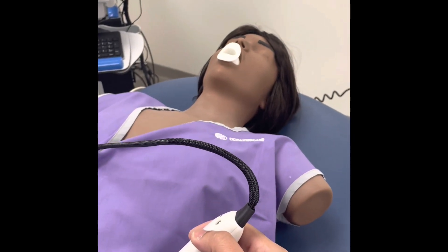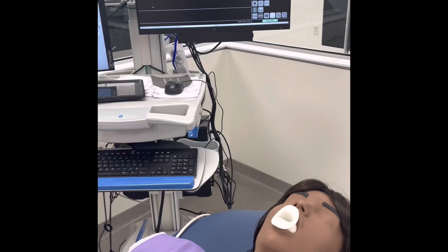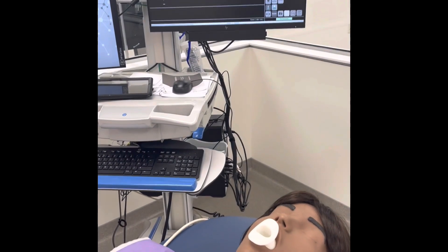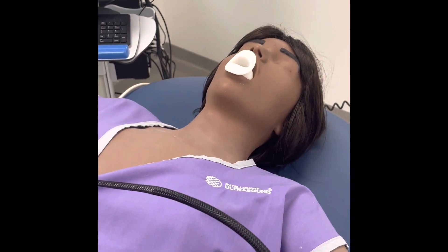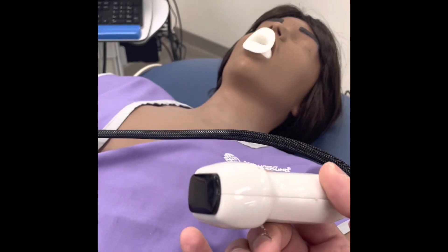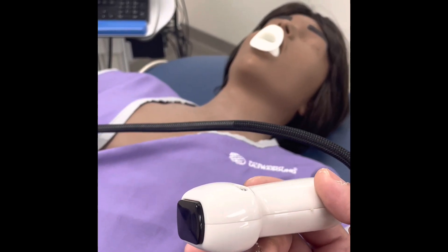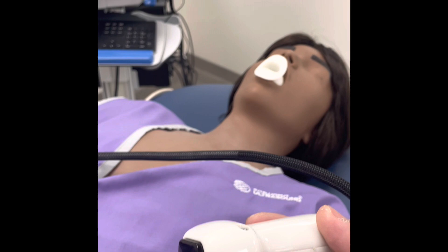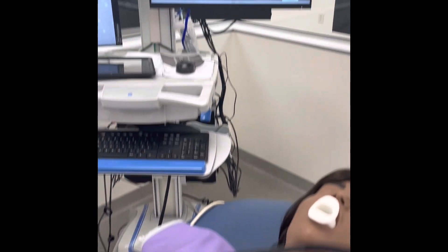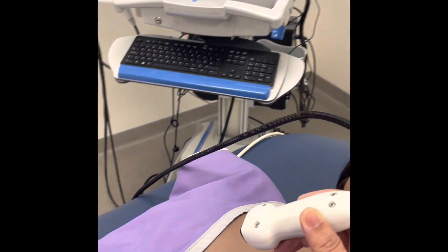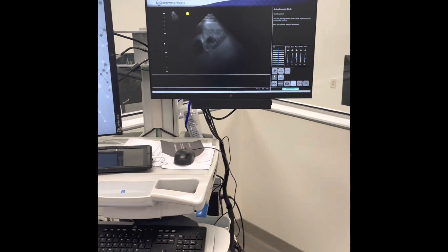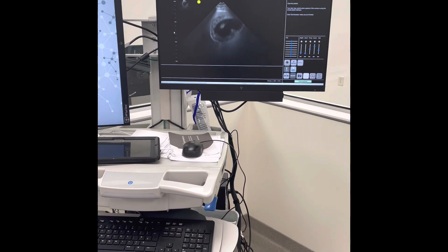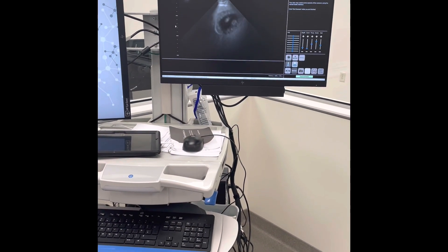This is Maya, a high-fidelity mannequin for doing all kinds of ultrasonography. If I want to do a TTE, I would do a TTE on Maya just like I would do on any normal person.